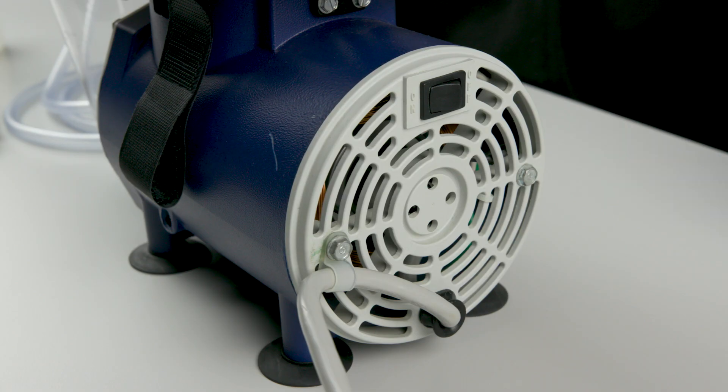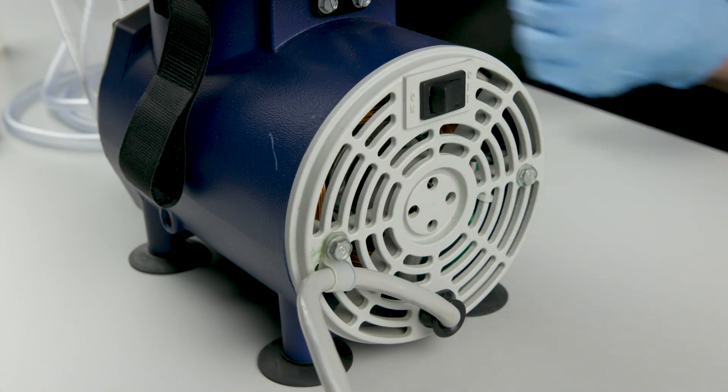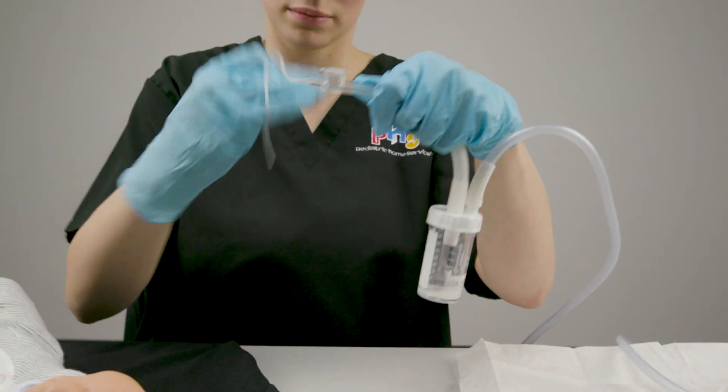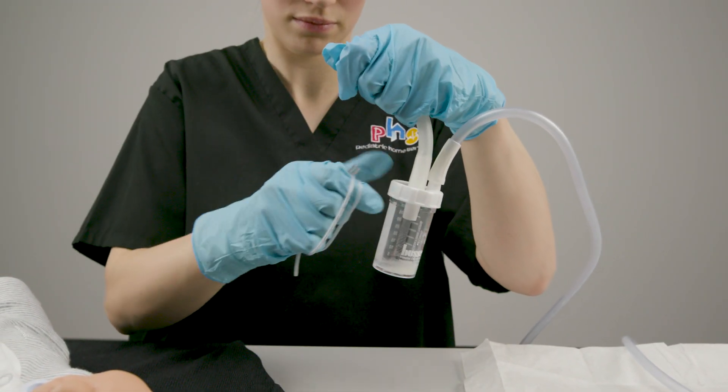When you finish collecting the sample, turn off the suction machine. Disconnect the specimen trap from the catheter and the suction tubing.